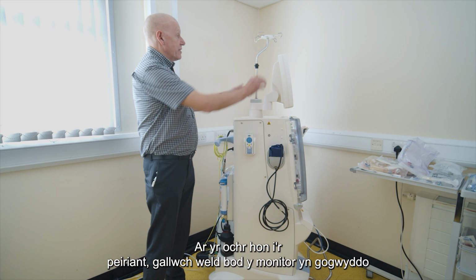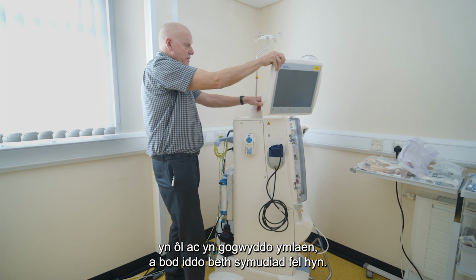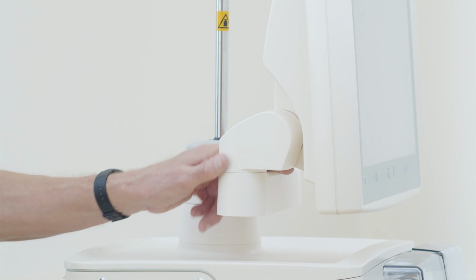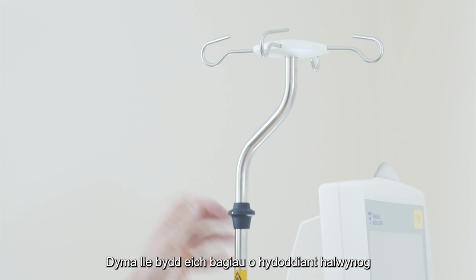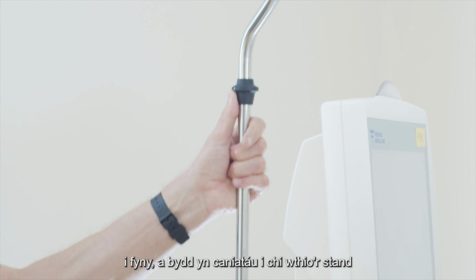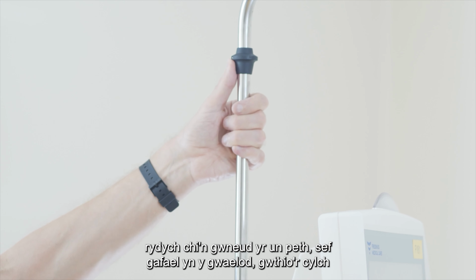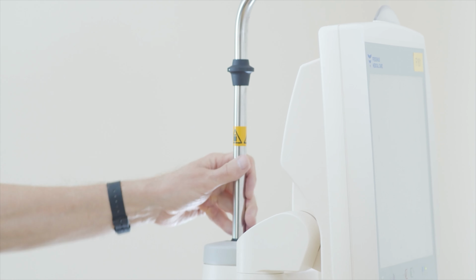On this side of the machine, you can see the monitor tilts backwards and tilts forward. It has some movement like that, so you can view the monitor when you're dialyzing. You can also access the drip stand, where your bags of saline will go. To move the drip stand up and down, hold that bottom section there and push that ring upwards, and it allows you to push the dialyzer drip stand up and down. To bring it back down, you do the same thing, hold the bottom, push that ring upwards, and it allows you to bring that back down.